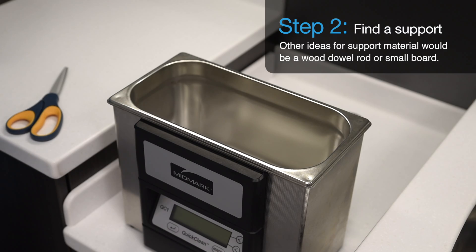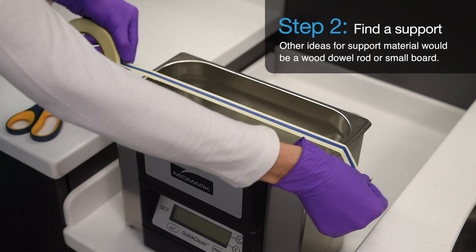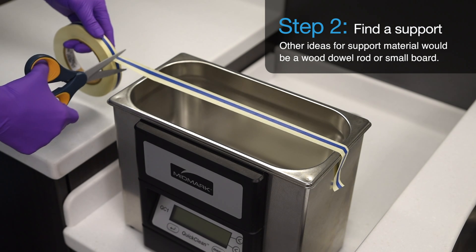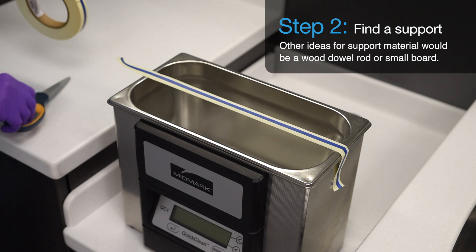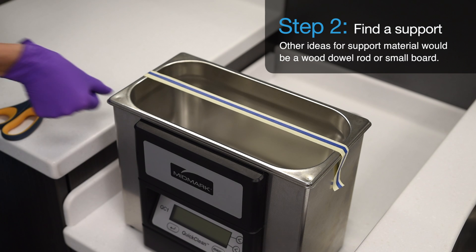Step 2. Make a support to which the aluminum foil will be attached. The material isn't critical — it just needs to be able to provide support that can be laid across the top of the tank. For this example, we will use a strip of autoclave indicator tape two inches longer than the length of your ultrasonic.